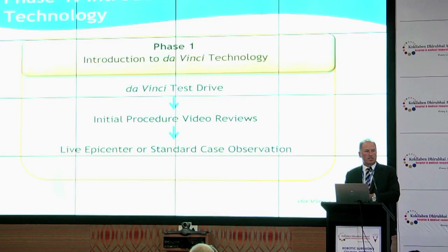To train a surgeon today who's not going to have access to a robot for a year or 6 months doesn't do anybody any good. It's a waste of that individual's time and the resources because the skill degrades over time, and we know that as well.